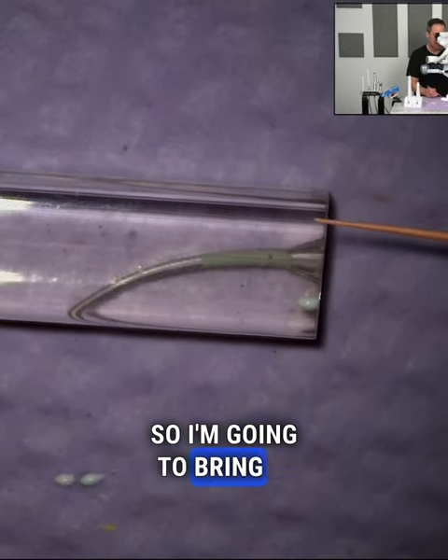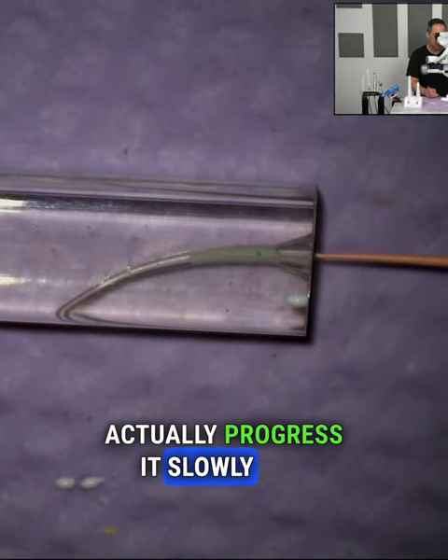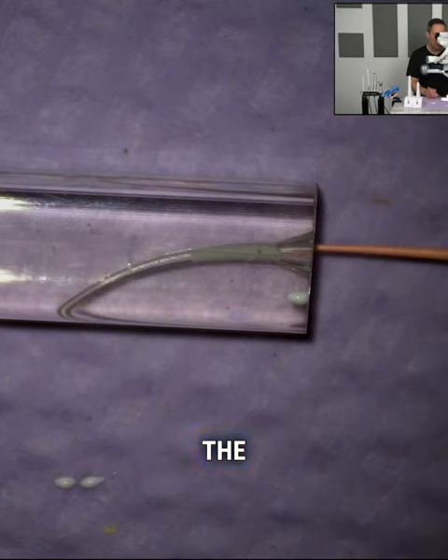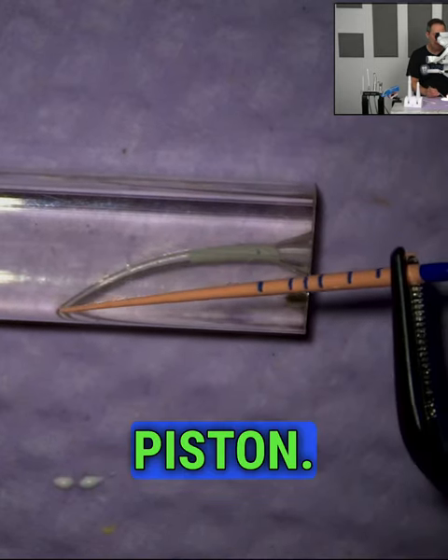I'm going to bring it in and progress it slowly. Watch how it actually carries the sealer down with it. It becomes essentially a piston.